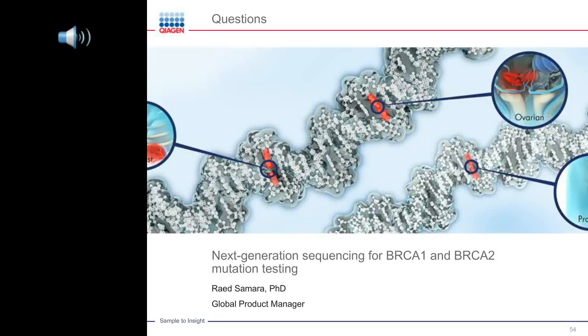Can genes be added to the panel? The panel by itself is a fixed panel. However, you can take the designs of the BRCA1 and BRCA2 panel and use them in a custom design where you can add as many genes as you want, up to maybe 160 genes.